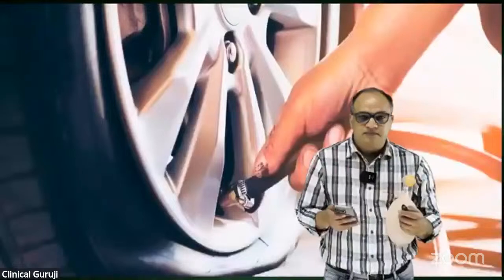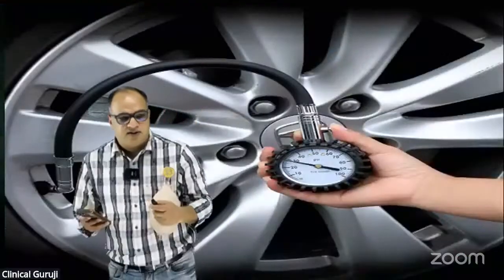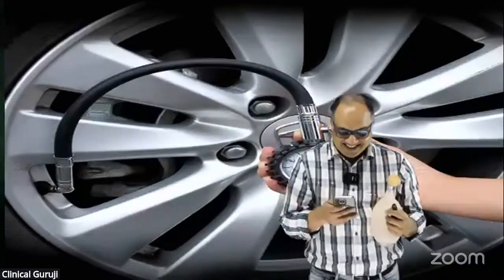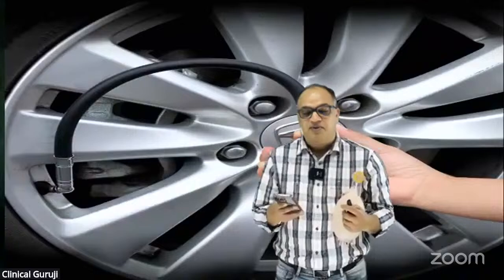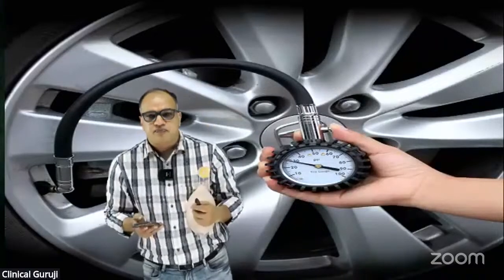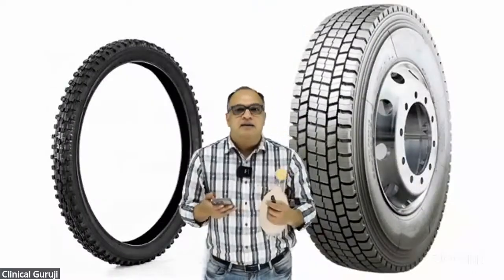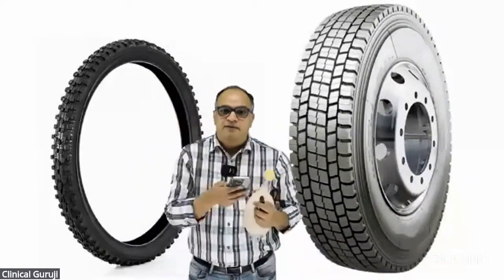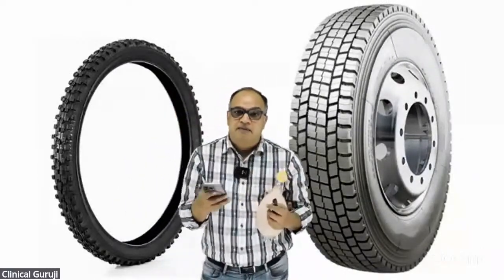That's a good answer. That will not blow out. You don't do it with lungs, yeah. Up to a fixed pressure, according to pressure. So we ask him to fill maybe like 30 psi, 35 psi, pound per square inch. This air will be different for a bicycle tire and a truck tire. The volume of air will be different for both these tires, but the pressure can be equal.